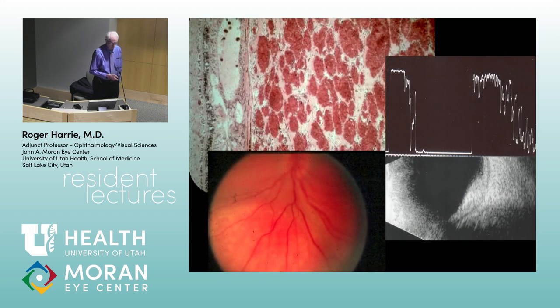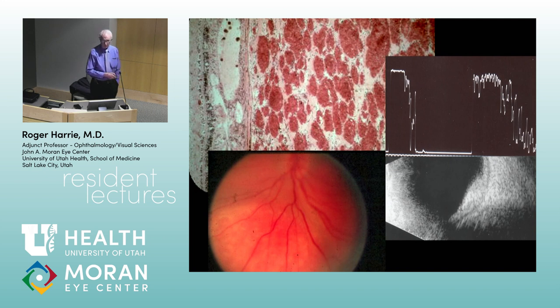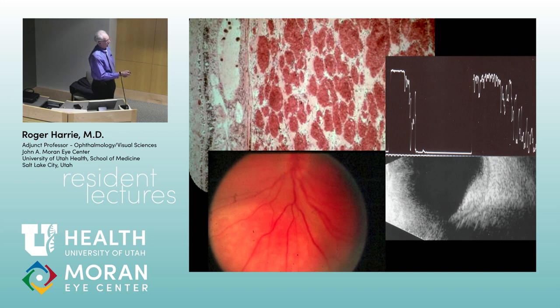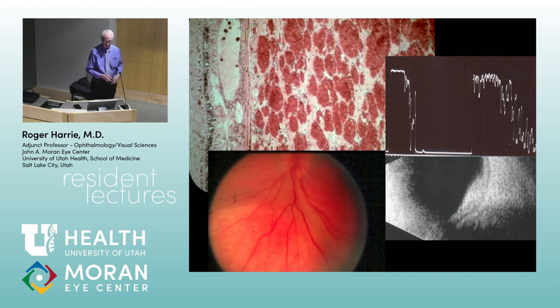To illustrate acoustic impedance: this is a choroidal hemangioma with a lot of interfaces. The vitreous cavity shows flatness on the A-scan corresponding to darkness on the B-scan — vitreous is homogeneous so you don't get much reflection. Once you hit the interface of the tumor surface, you get a high spike because you're suddenly changing impedance. Inside the tumor, hemangiomas still give high reflections due to many interfaces. Melanomas, being very dense and homogeneous, don't give these high reflections. This principle starts to help sort out pathology — you can correlate it to what a lesion is, both in the globe and orbit.